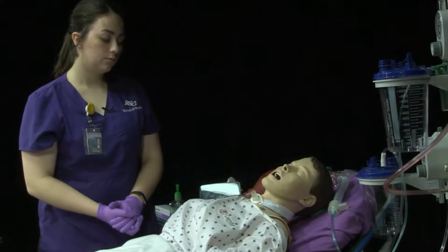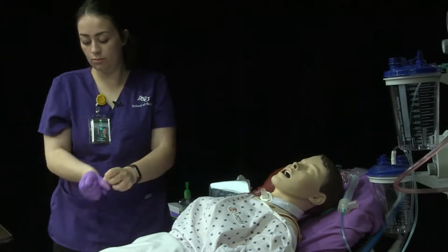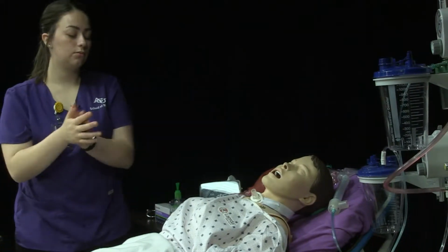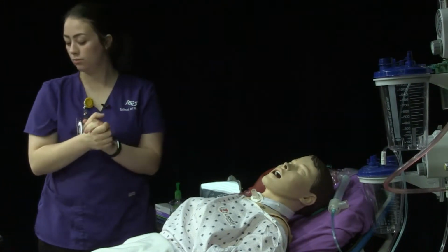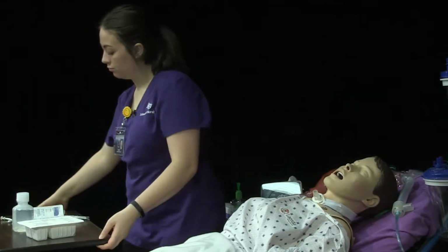Remove and dispose of gloves and perform hand hygiene. Open sterile tracheostomy kit, maintaining aseptic technique.